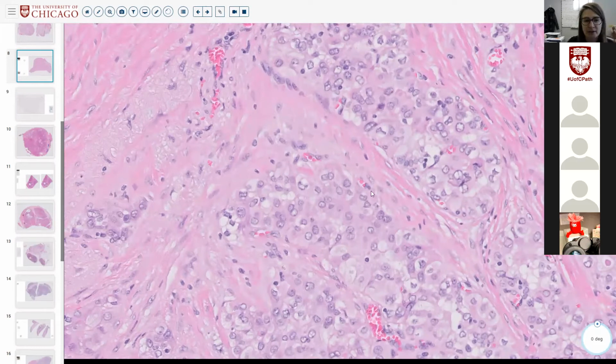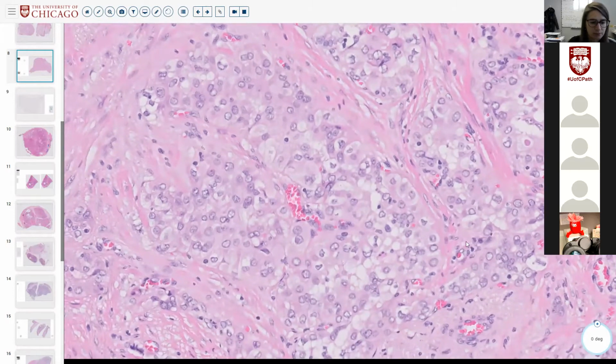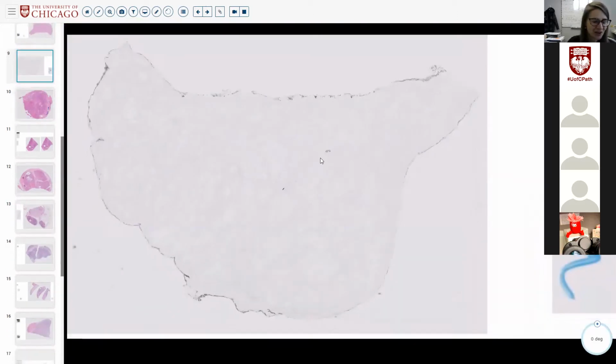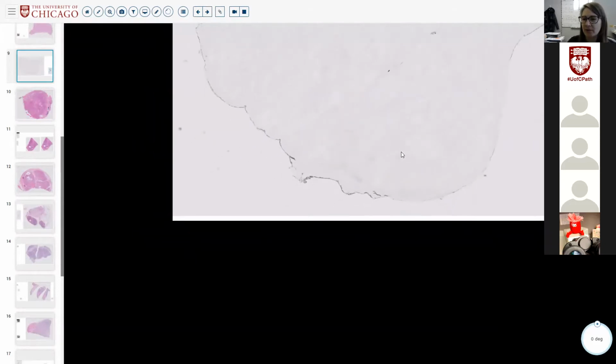Don't forget about the cytoplasm in PTC because it tends to be more voluminous than normal. Actually, that might be an inclusion right there. But what is something we can do? Well, the entire chat just blew up with that BRAF IHC. Yes, and you probably saw it on the next slide. No, I'm just kidding. Well done, Heather, Tanner, Perry, excellent. So this is our BRAF immunostain.